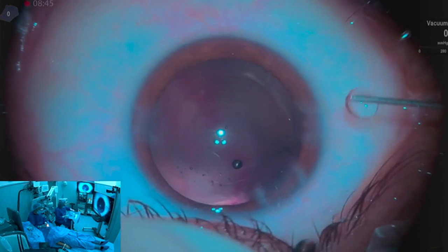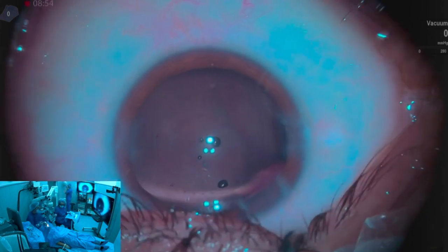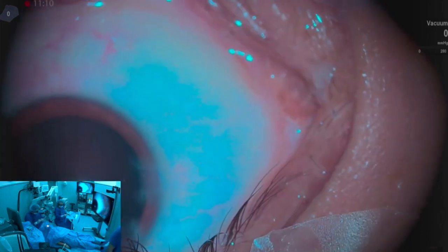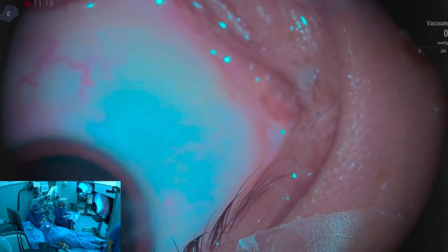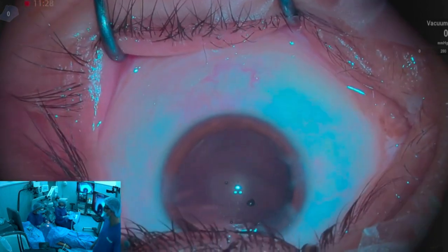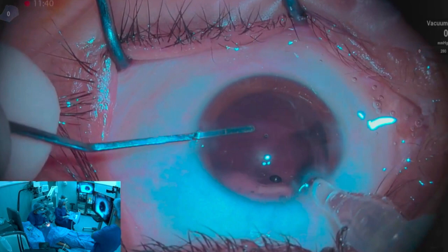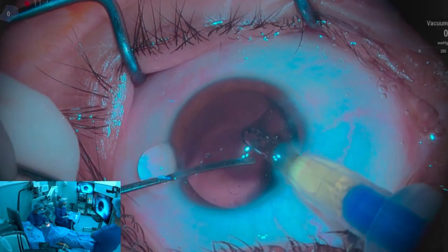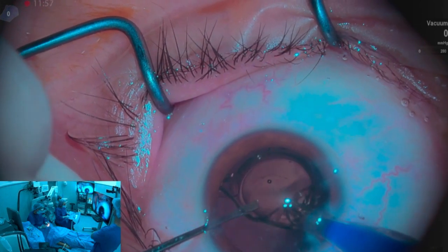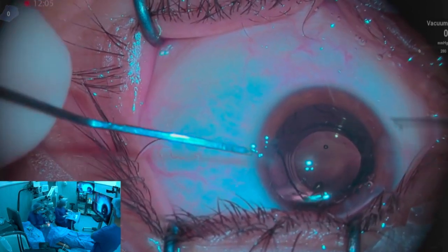It's fairly centered. Now I will put additional viscoelastic before the implantation to open the capsule. It is really important for the surgeon to load the lens now, because any issues with loading will compromise the end result. And to control the loading under the microscope to be sure that everything is fine. Now I like to place the spatula under the lens in order to prevent engaging the posterior hole of the capsule. This is the Synthesis EDOF lens. Four haptics.